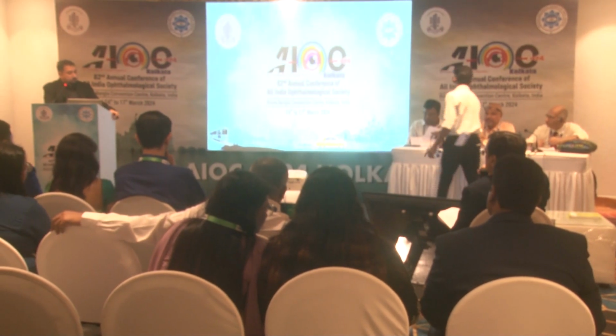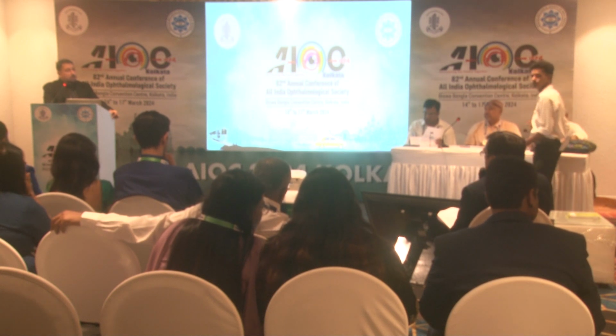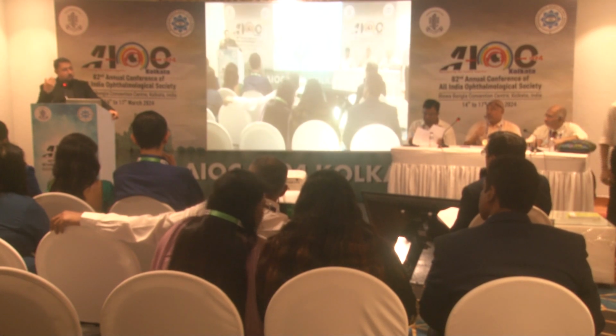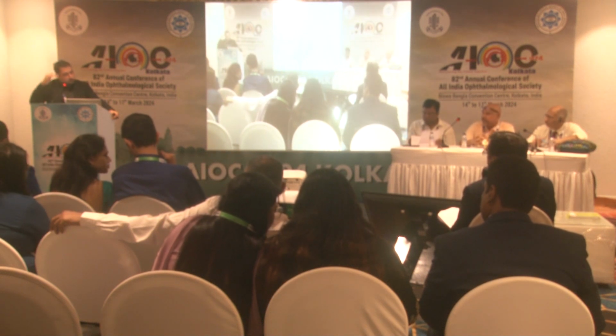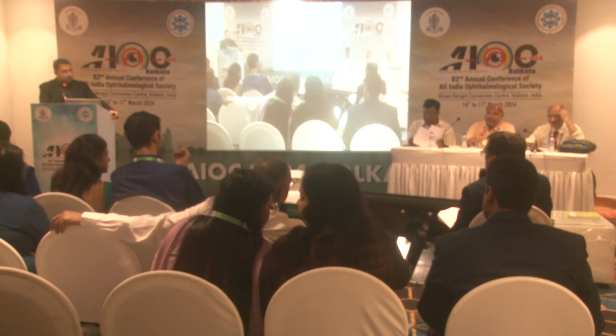So is there a stage where there is pigment proliferation with no shadowing? Pigment shadowing is called the RPC, retinal pigment clumps. There is a stage before that where you have middle retinal hyperreflectivity. You just have small clumps, but they're not big enough or solid enough to cause shadowing. Because pigment also produces VEGF, can that be somehow correlated to that?